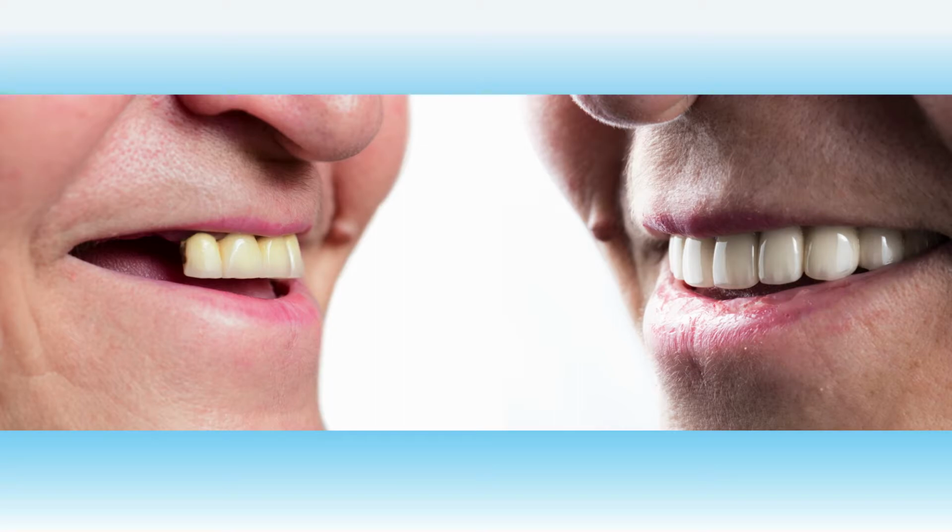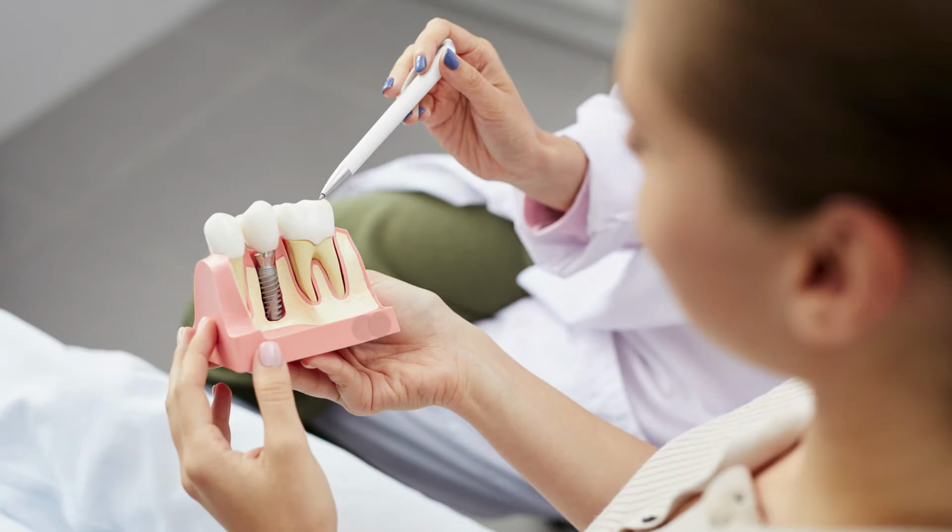Okay, so can you tell me how long they last as opposed to traditional implants? Yeah, I think it's comparable, but however, physiologically, you got to understand because they're smaller, you don't have as much bone around them, so they can break down a little easier. So you have to be very careful. Oftentimes, we'll put in more implants to supplement that possibility, but I think it's still functional and it gives patients an option maybe to get into something like an implant supported denture at a lower cost.